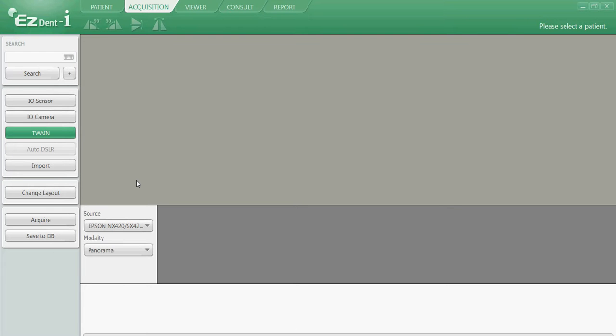In order to import our intraoral camera images, we must first start with our acquisition tab. Left click there, and then navigate down to our search window. Type in the name of the patient we are searching for, and then left click on search.